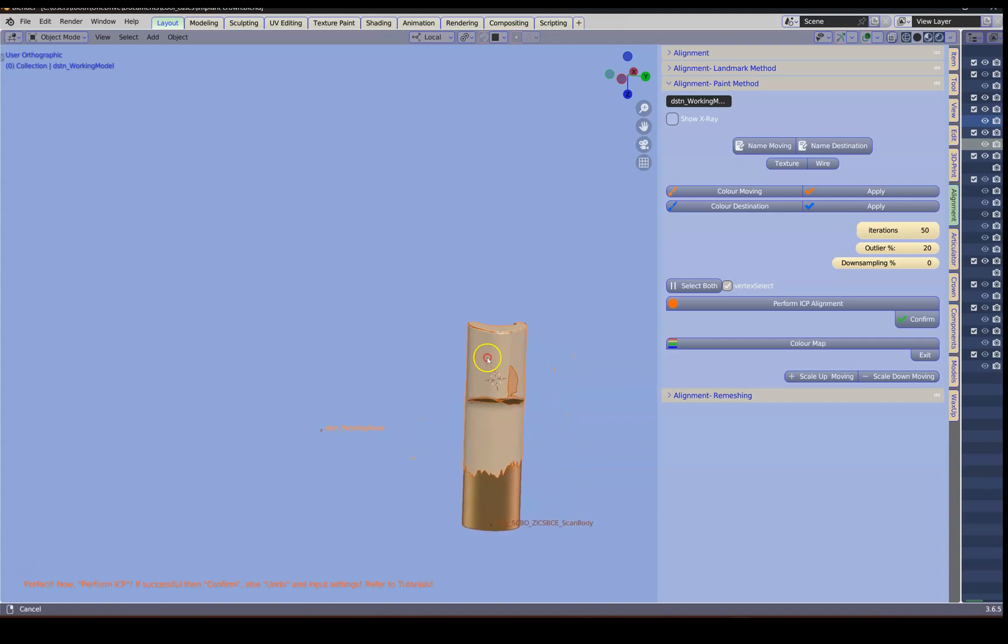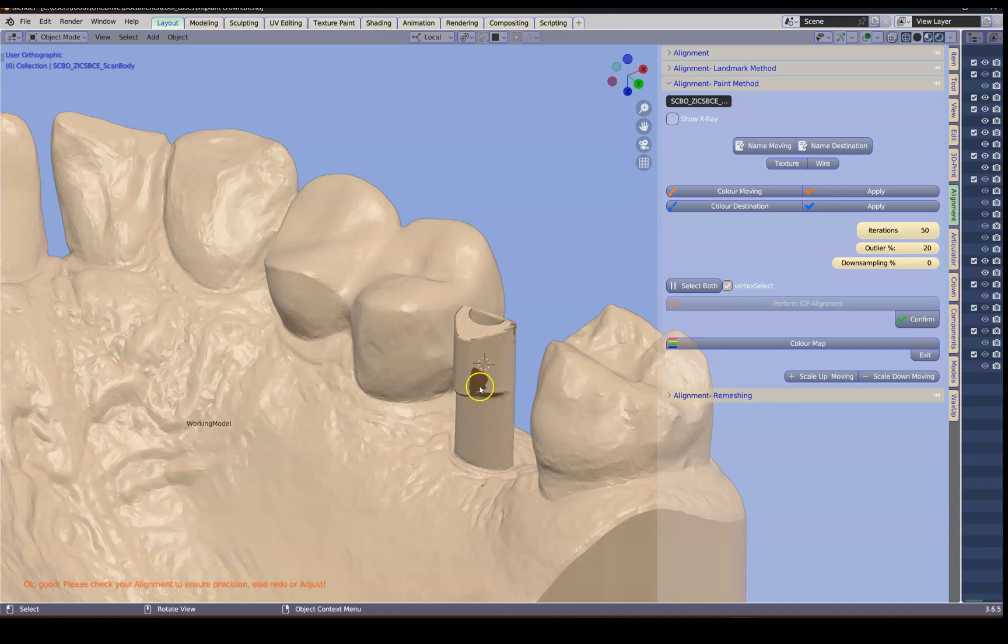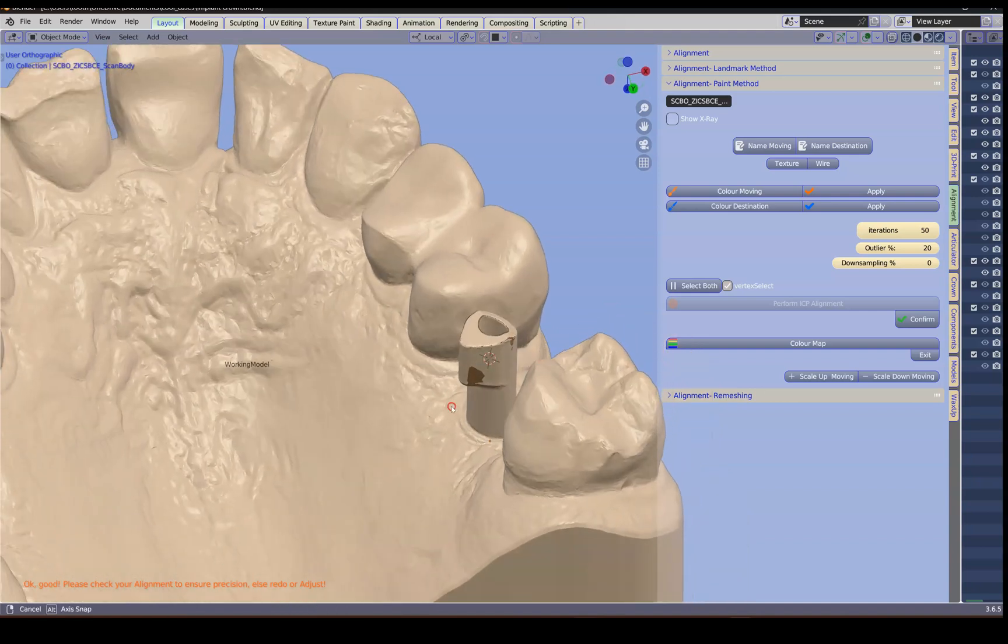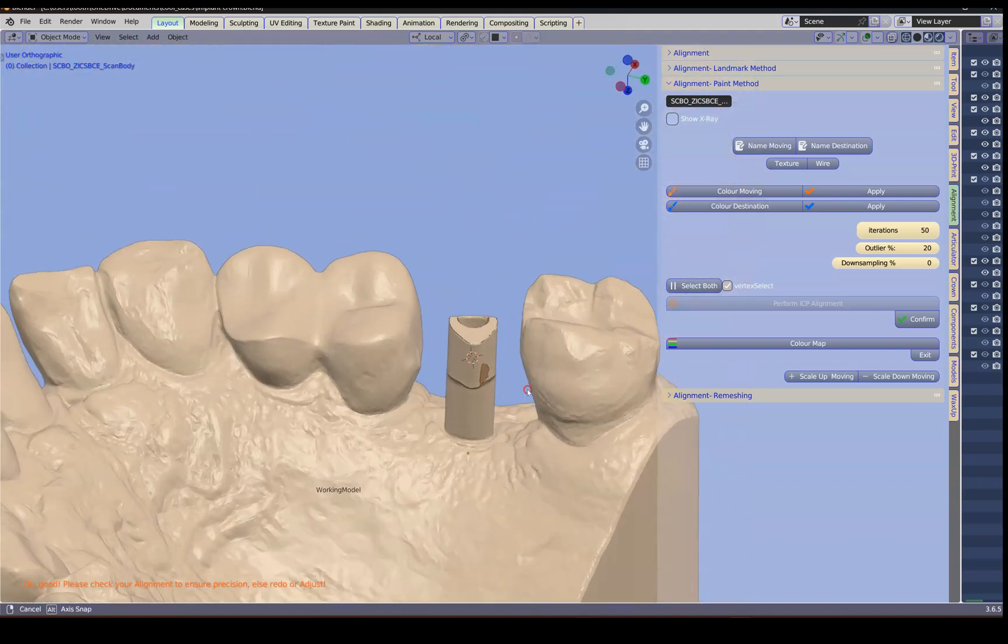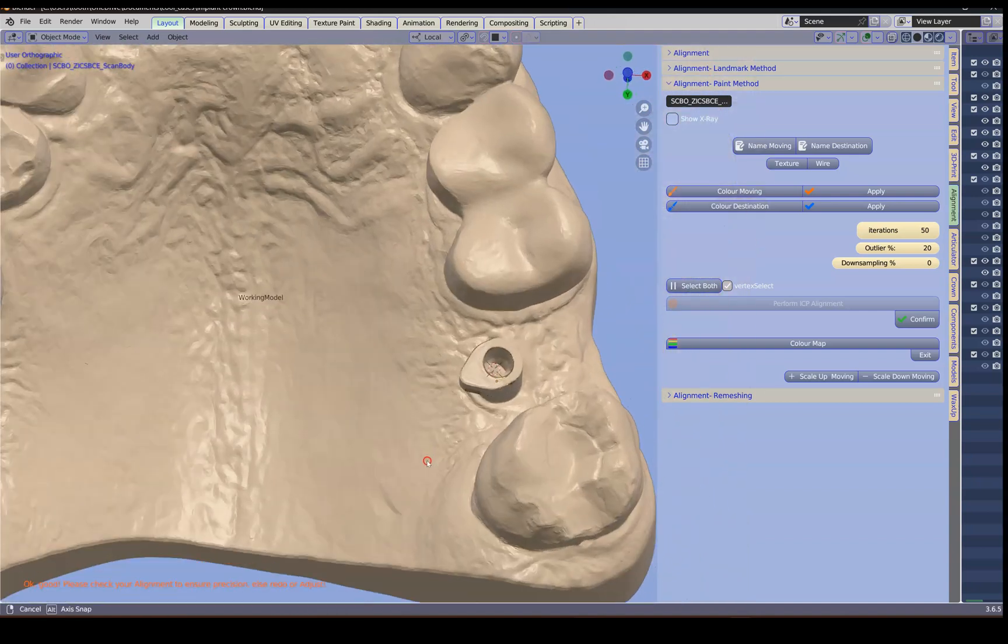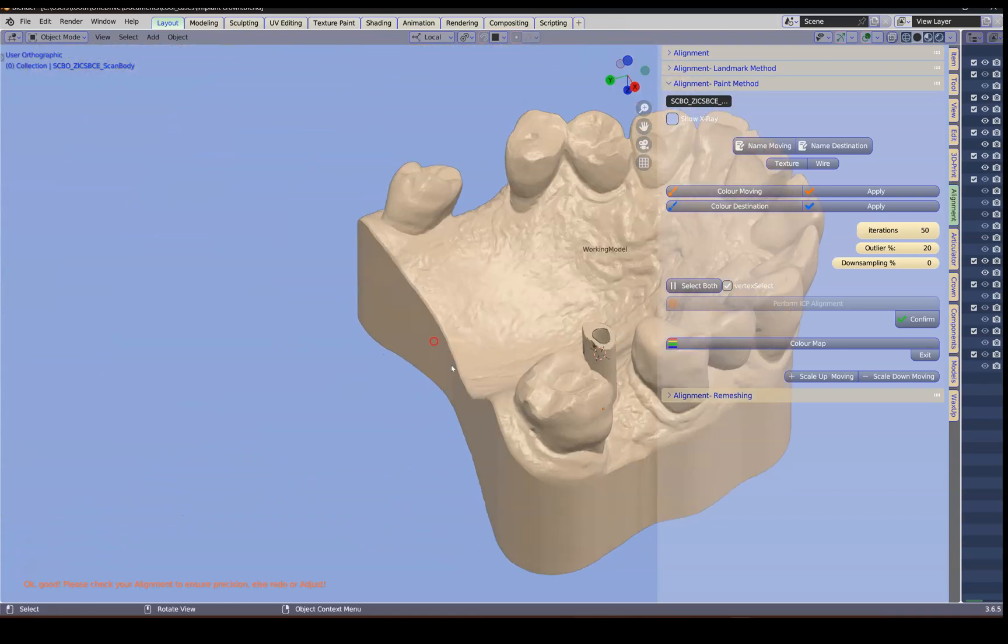This is looking quite good. Sometimes the scans aren't 100% so we see a little dab there. But generally speaking I think we've got a good alignment there.